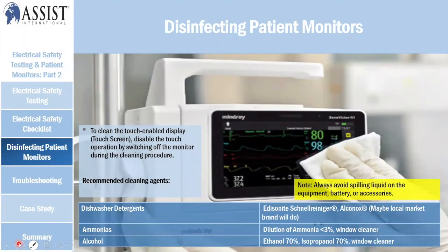The materials that you can use for disinfection are something like a local market brand dishwasher detergent, or diluted ammonia less than 3% with window cleaner. Alcohol, ethanol 70%, or isopropyl 70% with window cleaner. You can mix that. That will be a recommendation for touchscreens, so you can keep it clean and you don't have any transfer infection or something like that.